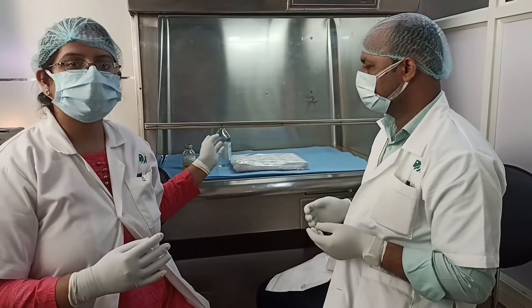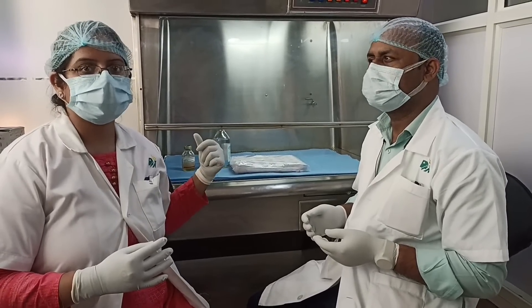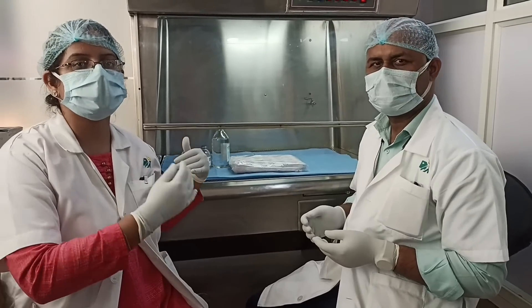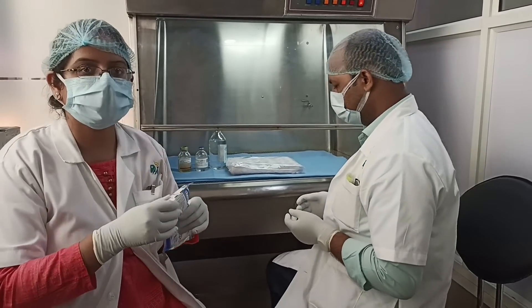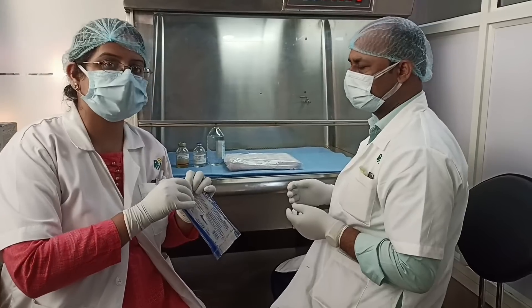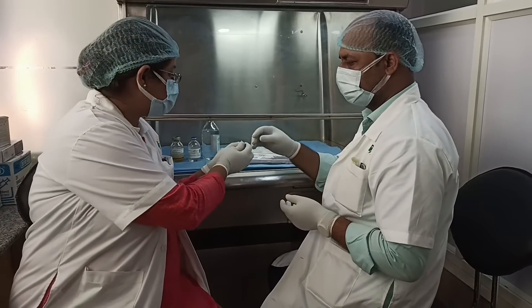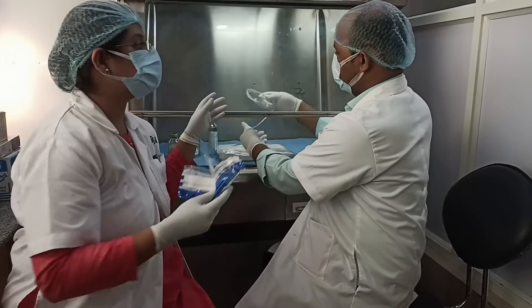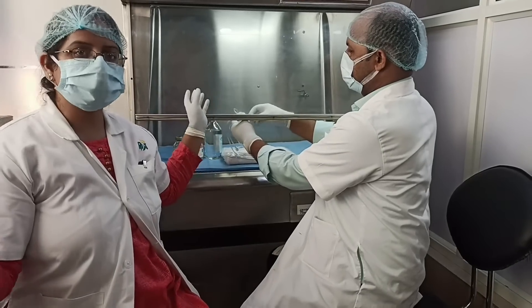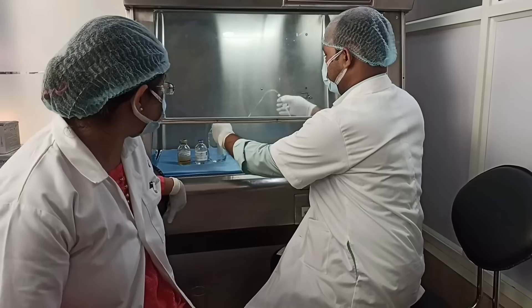First, we will take the 500ml glass bottle of normal saline and empty the bottle in order to prepare the solution inside it. We will be using an IV set to empty the bottle, so as to maintain sterility. We have to ensure all items are opened inside the laminar hood to maintain aseptic conditions.